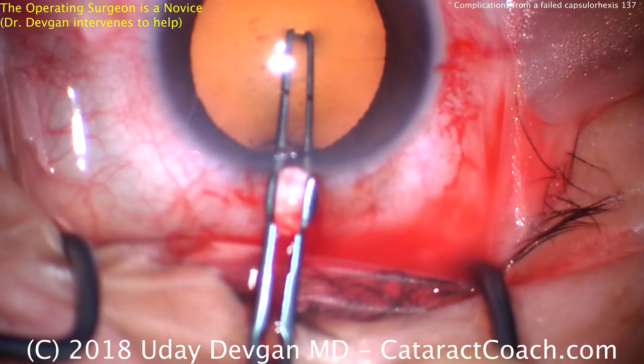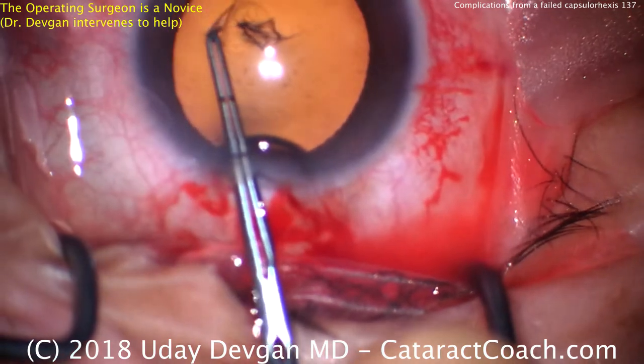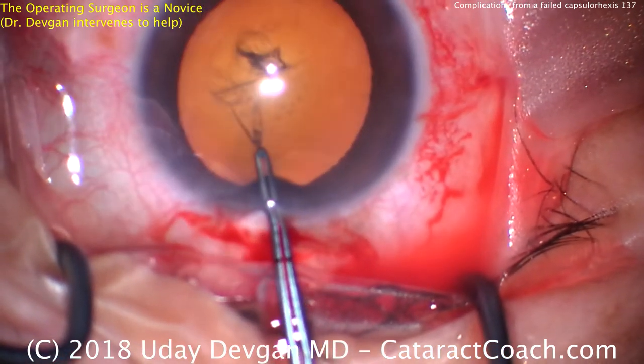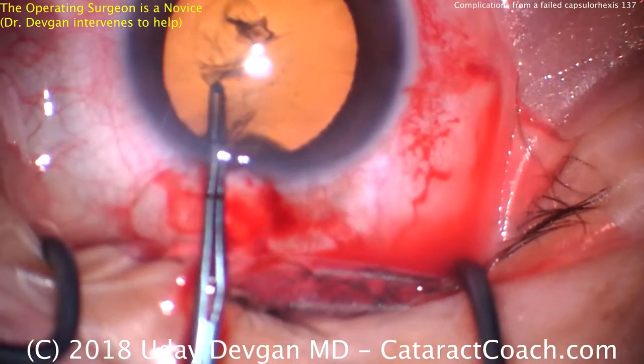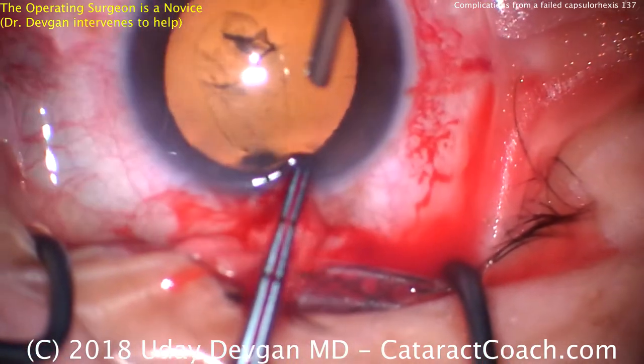To create the capsulorhexis, the novice surgeon pokes into the capsule, isn't sure what he's grabbing, and starts pulling. It's a little bit flipped over, and here's where you should stop, grab, and rotate. Instead, he pulls straight towards him and right out of the eye.